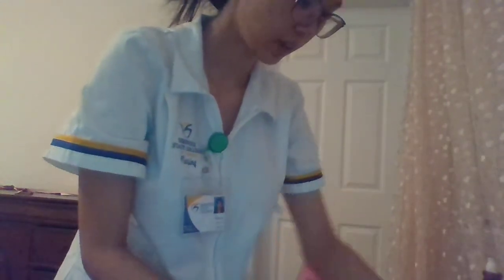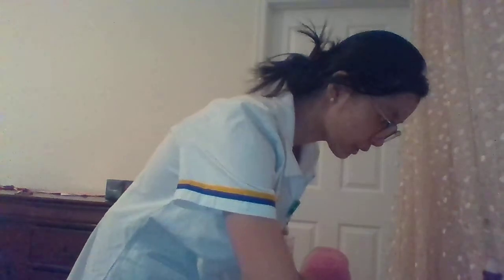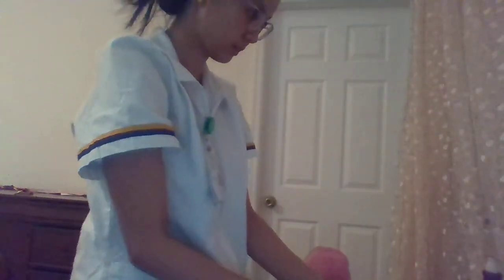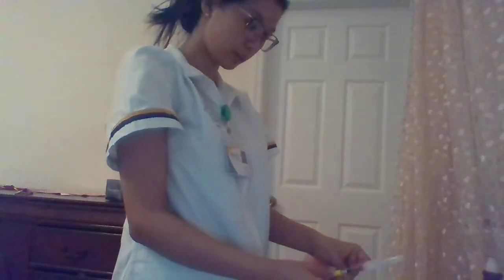After that, I'm going to label my syringe as well with the patient's name, which is Anna Pulaski. The medication is influenza vaccine. The amount is 0.5 milliliters. And my initials and today's date and time. And I'm going to check the healthcare provider order and the patient's allergies one more time and verify the 6 rights at the patient's bedside.